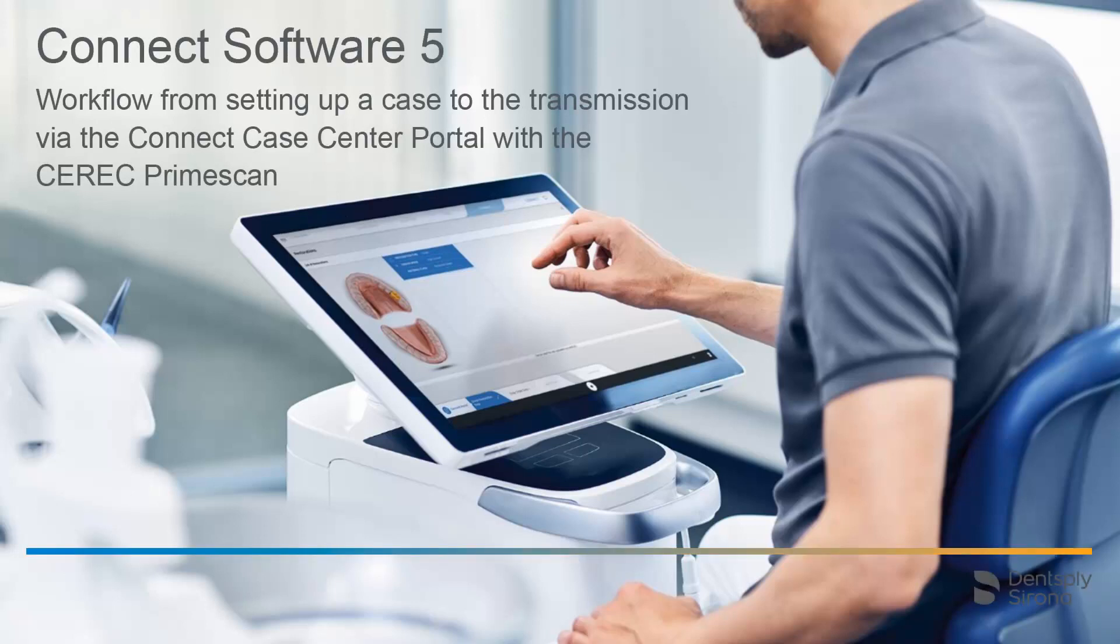Welcome to this video tutorial on the topic of Connect Software 5. In this video, we will demonstrate the workflow from setting up a case to the transmission via the Connect Case Center portal with the CEREC PrimeScan.